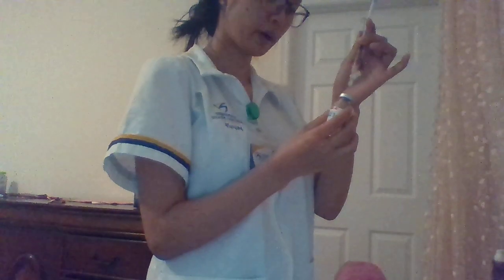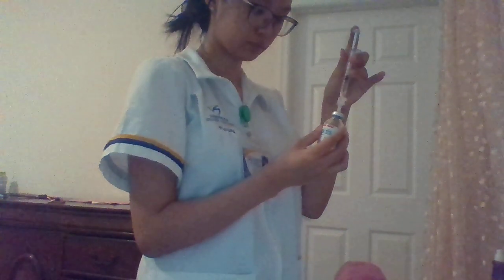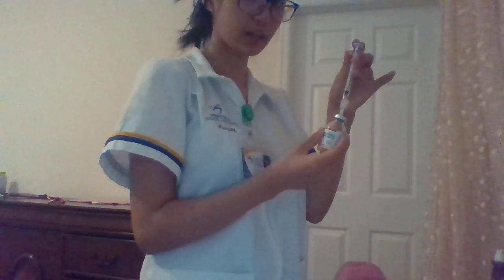Okay. And I'm gonna insert the air into the vial to make sure it has an equal pressure, and I'm gonna withdraw the medication.